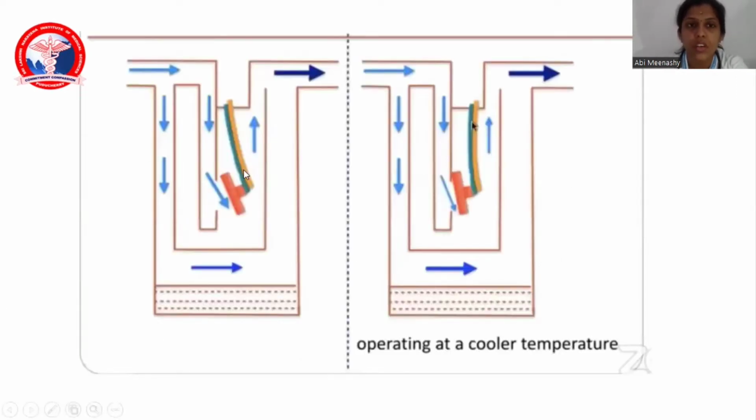So this is your bimetallic strip. The blue is metal A and yellow is metal B. Both have separate coefficients of expansion. Again, this is your bypass chamber, and this is your vaporizing chamber. When temperature increases, what will happen? We need more gas in the bypass flow and we need less gas in the vaporizing flow.